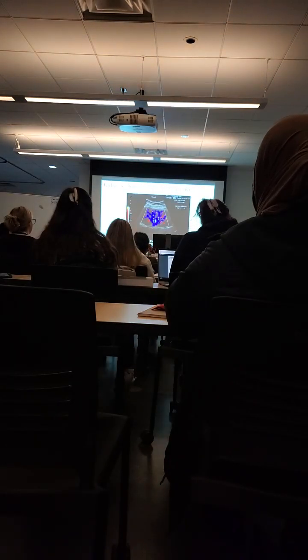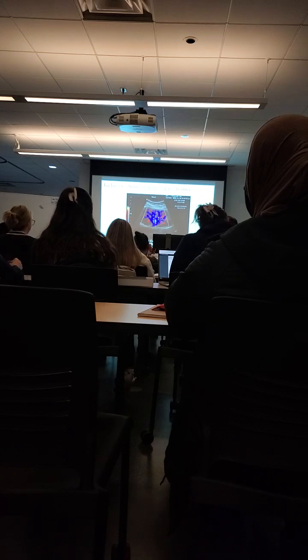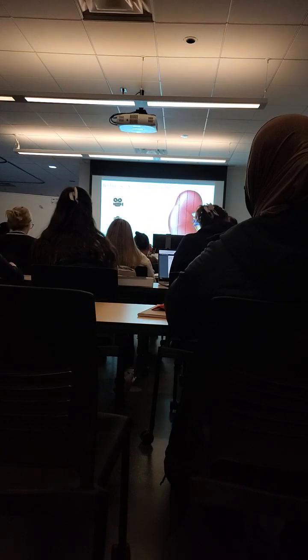Then what they want you to do is take a picture lateral, then mid, and then medial. And when you're at medial, that's where you're going to see vessels. That's also where you're going to see hydro. So you're going to put some color on that, and it's going to light up like a Christmas tree, and that's going to be your medial aspect. So if we go back, that's your medial. Then if there was hydro, these wouldn't fill very fast because you would have a bunch of anechoic spaces. So you will know.